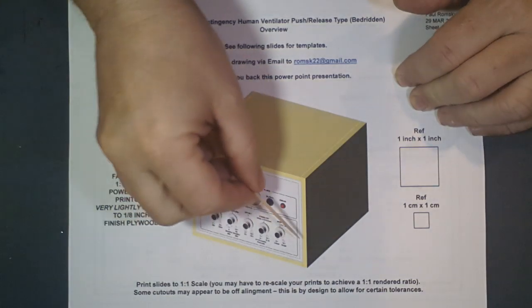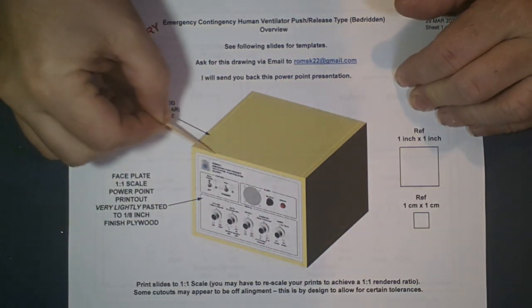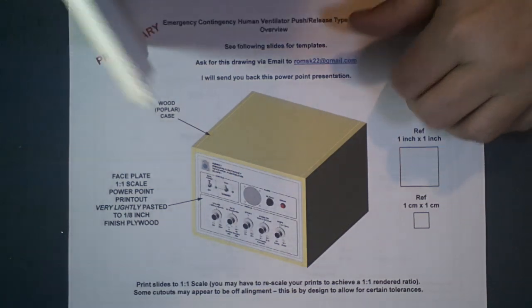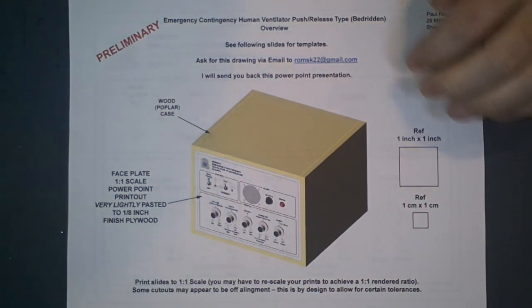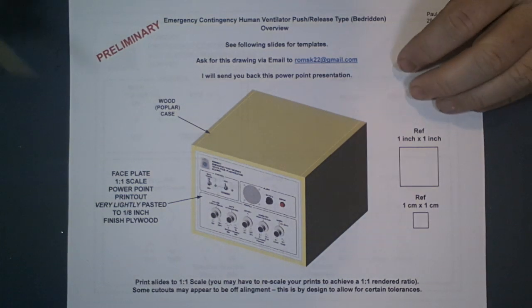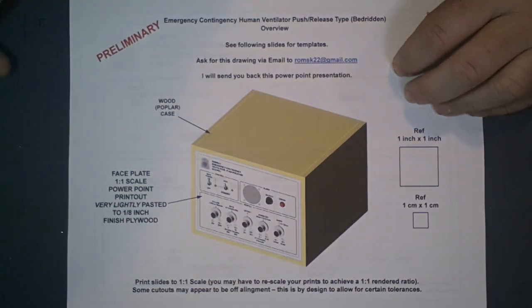And basically what you do is when you make the box, you put a small notch around all these pieces of the wood here as it fits together, about halfway deep and about 1/8 inch thick, the notch, so it would hold the plate in place. And get this back in here, all right? And that holds the plate in place, and then all the stenciling is just on print. And then what I do is I put very, very thin coats of polyurethane sealant over it.